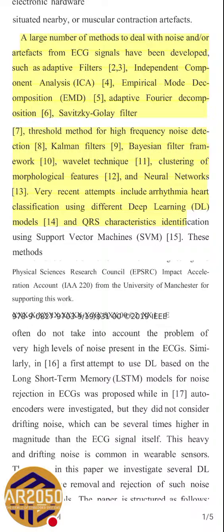So here in the passage, we learned about a lot of techniques that are being used in the ECG denoising literature.